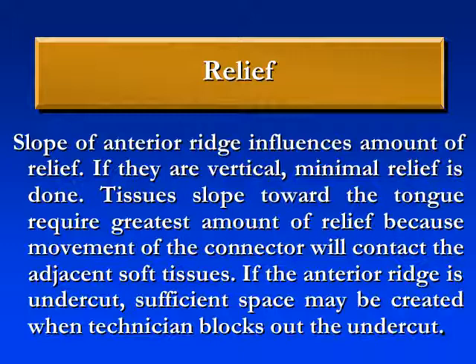If there is vertical dropout of the lingual soft tissues or the lingual ridge, minimal relief is done because there is no possibility of contact between the metal framework and the tissues. But if there is a slope of the tissue toward the tongue, we are talking here lingually, that requires the greatest amount of relief, because the movement of the connector will contact and lacerate the adjacent soft tissues.